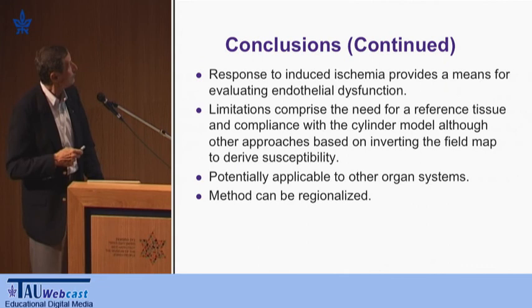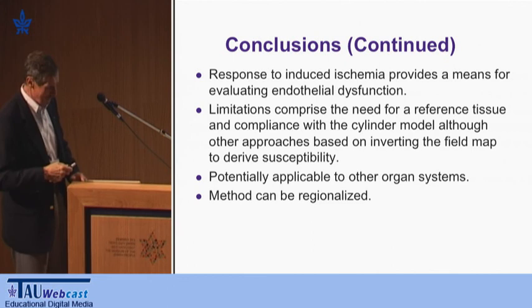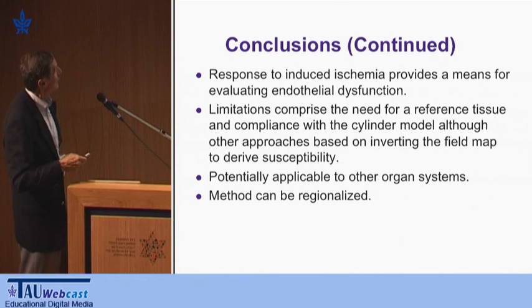The technique, like any other method, has limitations. And one is the need for a reference tissue. Another one, which I did not mention here, is if the orientation of the vessel exceeds 30 degrees relative to the static magnetic field, then there is increasing inhomogeneity of the reference region.